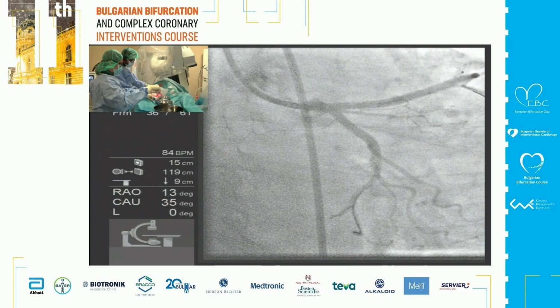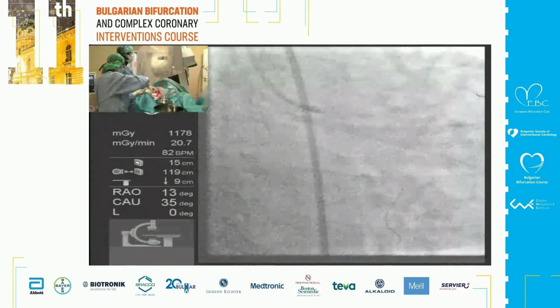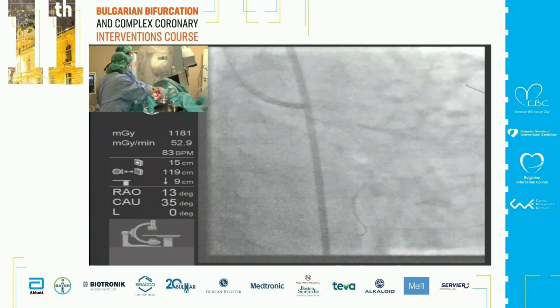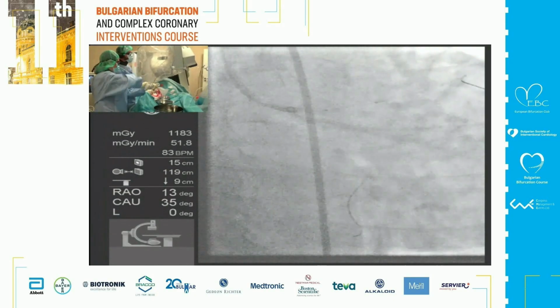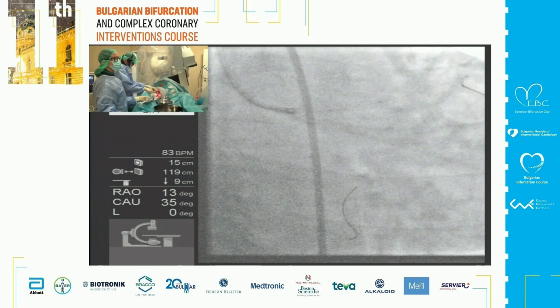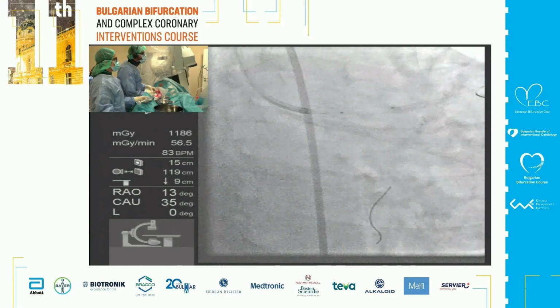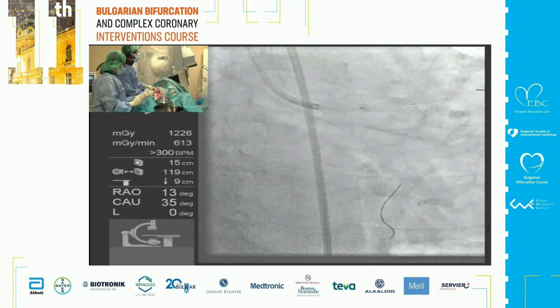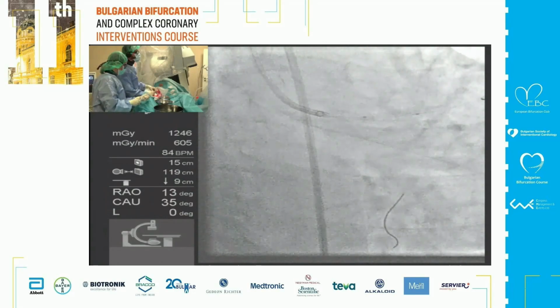We have the luxury of having you and getting your distilled experience and opinion. I like the fact personally that we didn't do the IVUS in advance, because we have seen many times the IVUS-guided intervention. We said, okay, let's see what the reality is, which is the reality that in many institutions and many labs imaging is not available for many reasons.